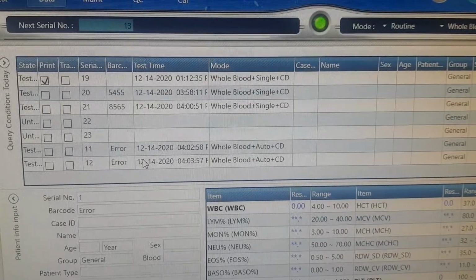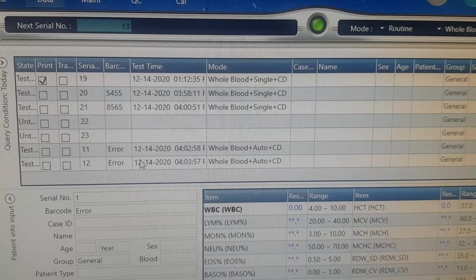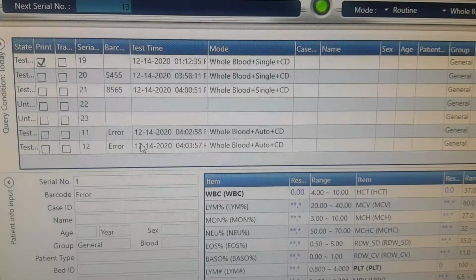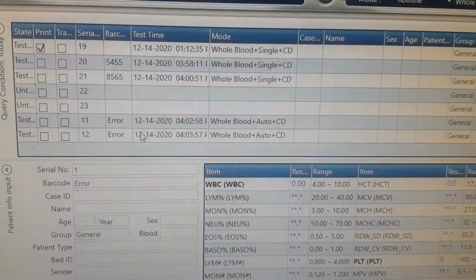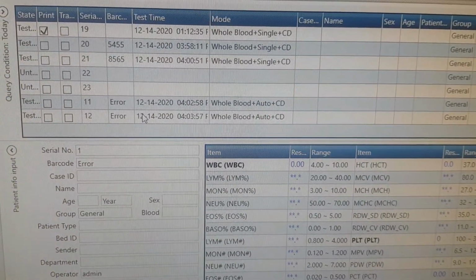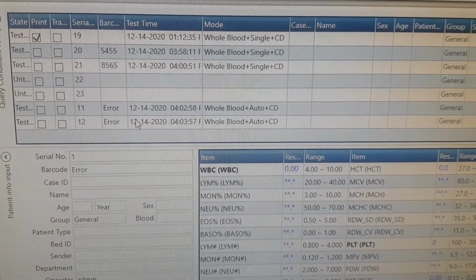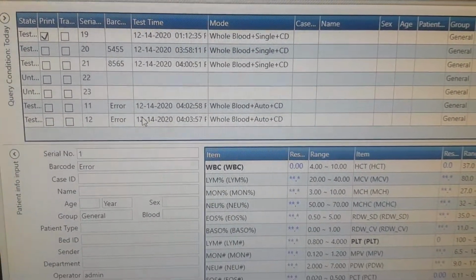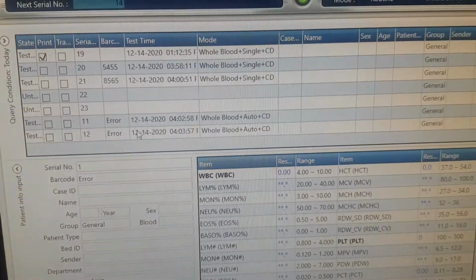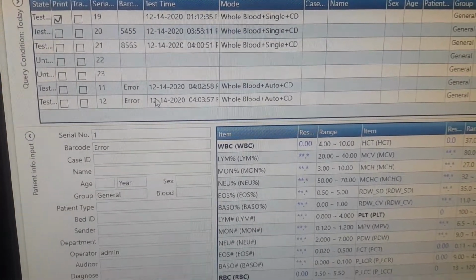And now it is analyzing the third sample in the fourth position of the rack. So now the serial number will be 14 instead of 13, because in 13 position we did not put any tube. In the rack the third position was empty. So the analyzer will show us the result with the serial number 14. So this is how we can, I think we can distinguish that in which position there is no tube and in which position there is tube.